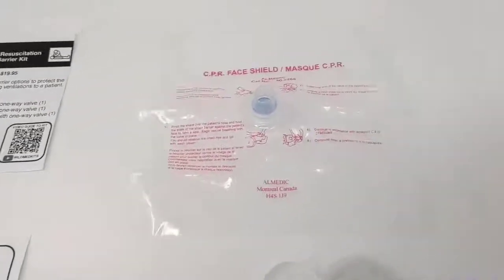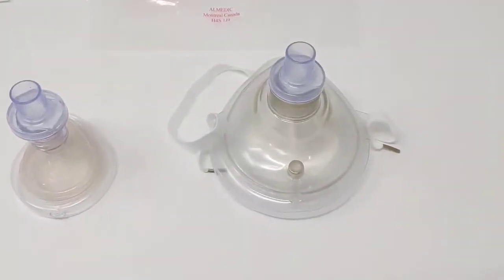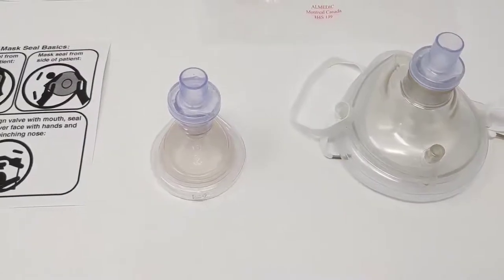This kit includes a universal face shield with one-way valve, an adult pocket mask with one-way valve and strap, and an infant pocket mask with a one-way valve.